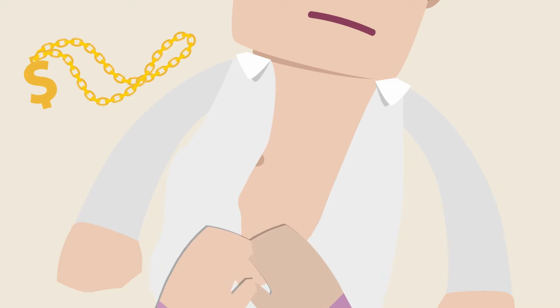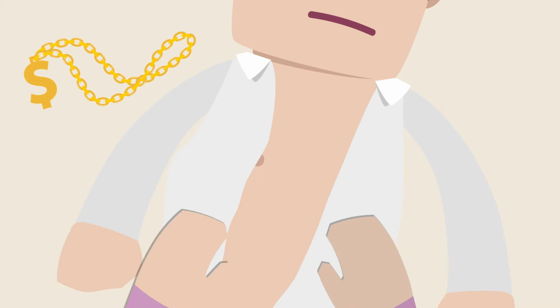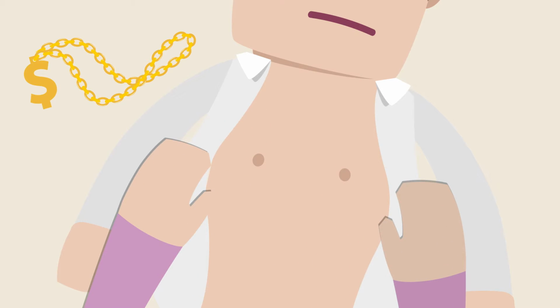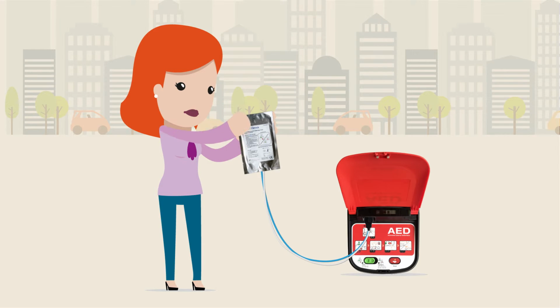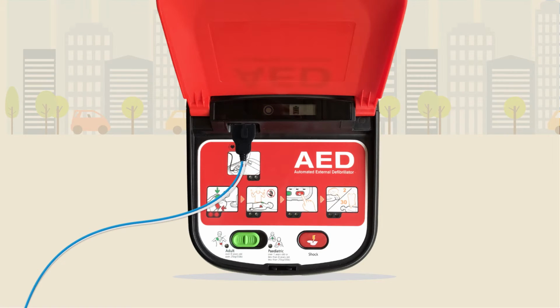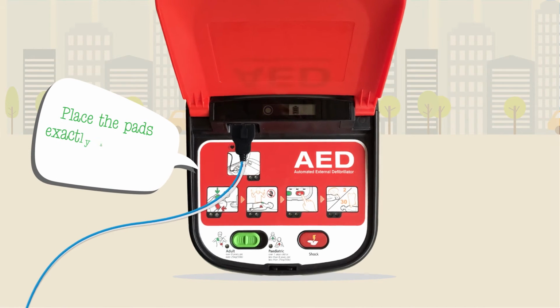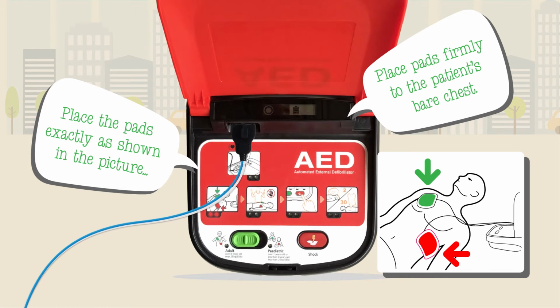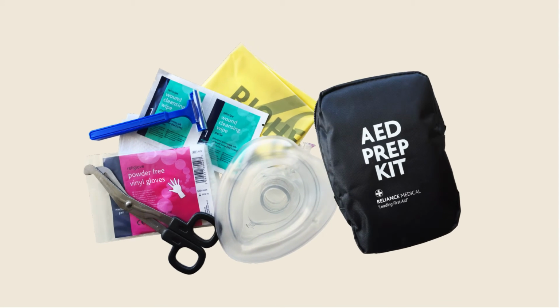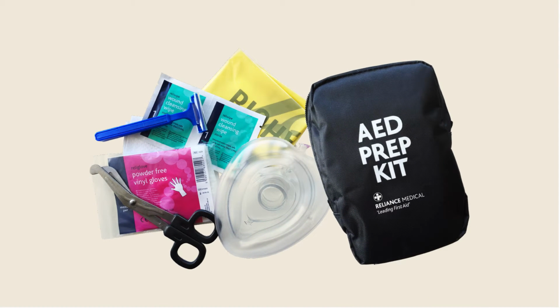Make sure to also remove anything that may contain metal, like jewelry and bras, as the metal conducts electricity and can cause burns. Remove the foil packet on the pads and select the option for Adult on the front of the unit. You will then be instructed to place pad exactly as shown in the picture. Press pads firmly to patient's bare chest. If the person has a lot of chest hair, you may have to shave them. The unit may have an accessory prep kit, which includes a shaver.